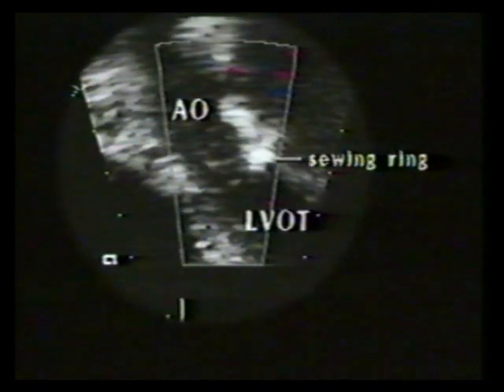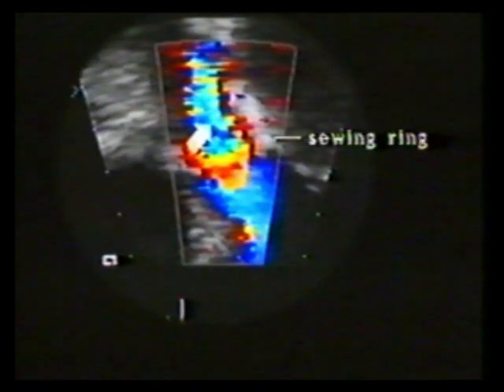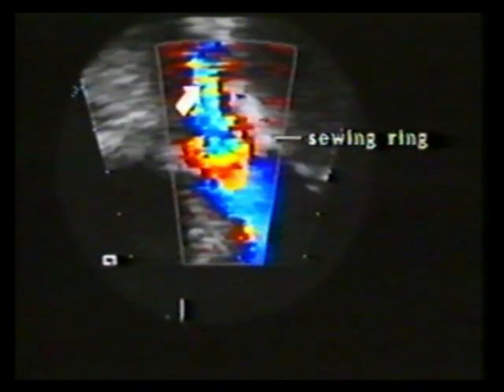The examiner must take care not to place the pulsed wave sample volume too close to the prosthetic aortic valve sewing ring. This is an expanded apex down view of the LVOT and ascending aorta. This is the sewing ring of the same Carpentier-Edwards prosthesis that we used for demonstration of the LVOT diameter measurement. Color flow imaging shows the expected jet beyond the prosthesis in the ascending aorta. This is the sewing ring.